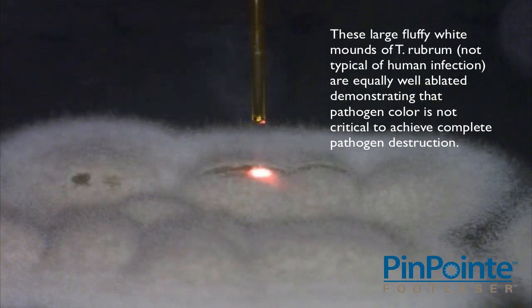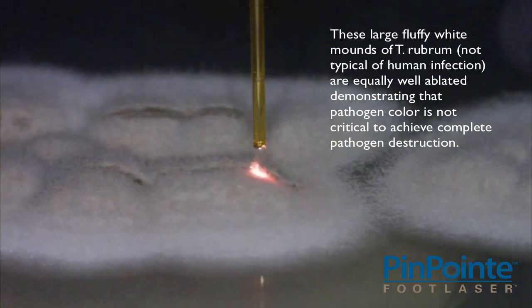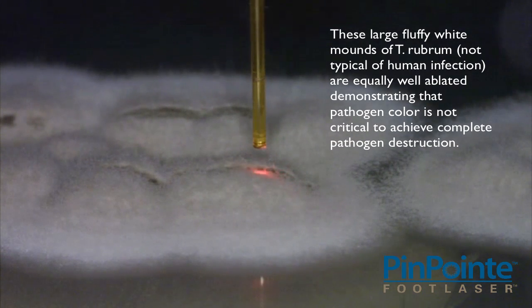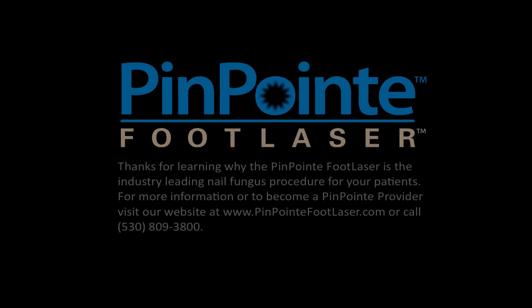These large, fluffy white mounds of T. rubrum, not typical of human infection, are equally well ablated, demonstrating that pathogen color is not critical to achieve complete pathogen destruction.